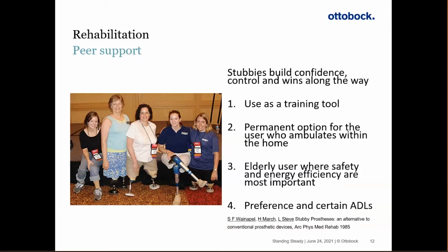Stubbies can also be a permanent option for the user who ambulates within their home, as I mentioned before, and maybe the elderly user where safety and energy efficiency are the most important. Some people still use their stubbies for certain ADLs. They'll design stubbies for specific activities.